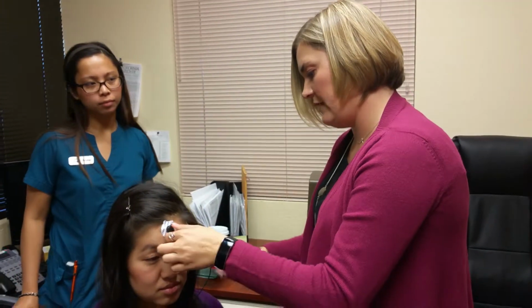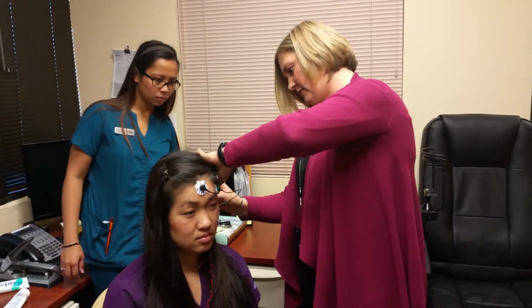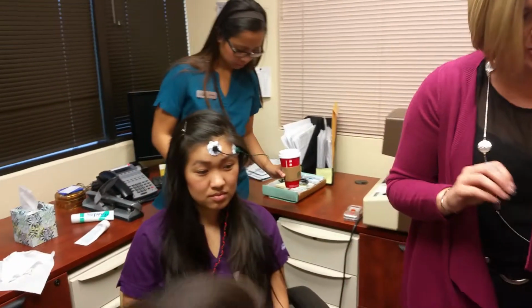Okay, and then we're just going to twist these around so they're not hanging in her face. And then we're going to lightly tuck this behind her ear. Alright, and then we're going to measure her out for 39 inches. We need the ruler.